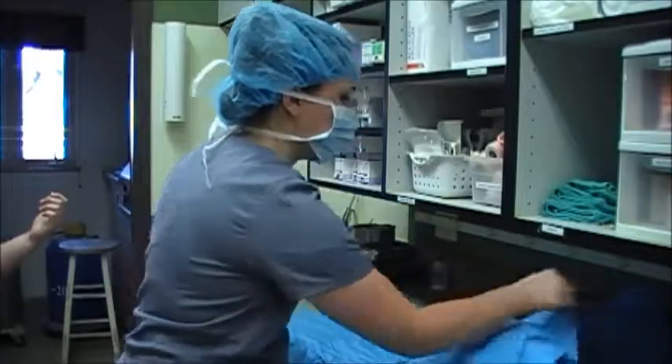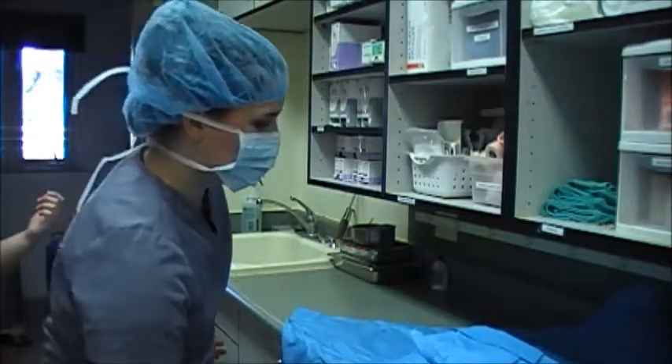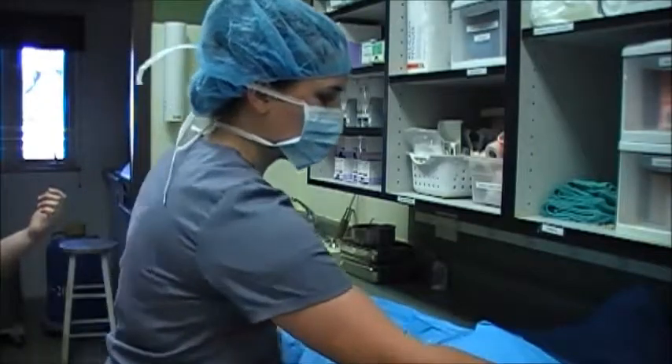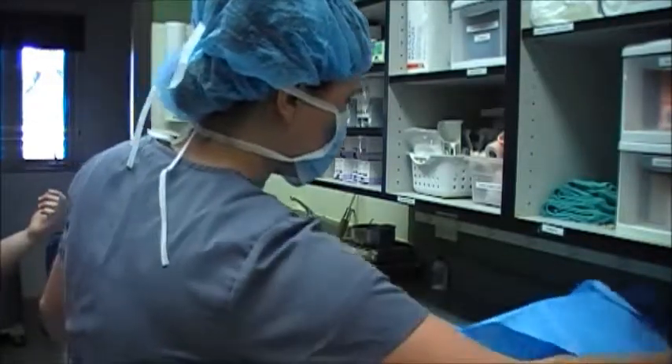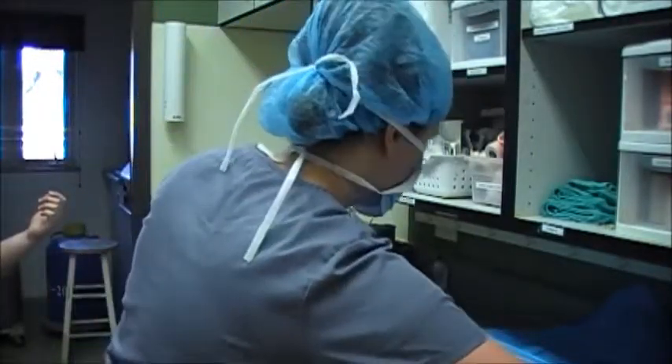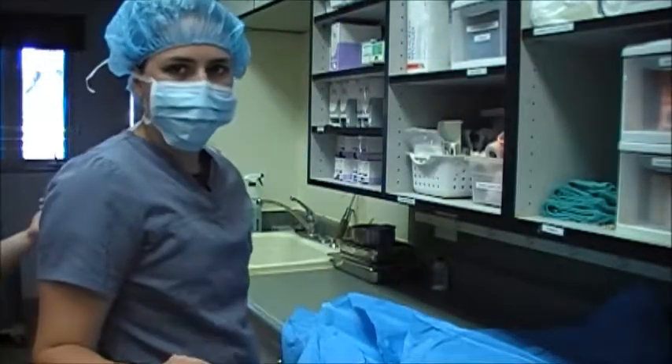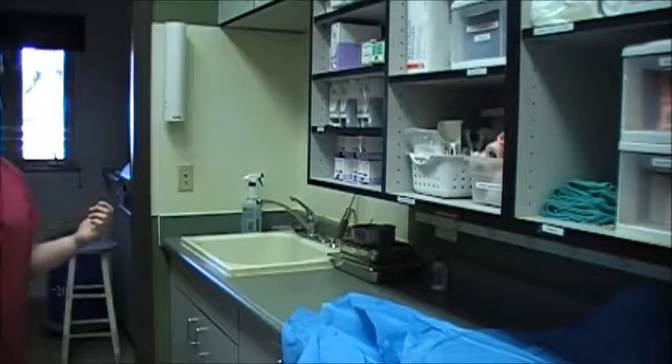I'm opening and pulling my flap away from my field without reaching over top. I'm going to leave the last of my flaps for my sterile doctor to open so she can come pull that one and then get her towel and gown out. So I'm just going to step out of her way.